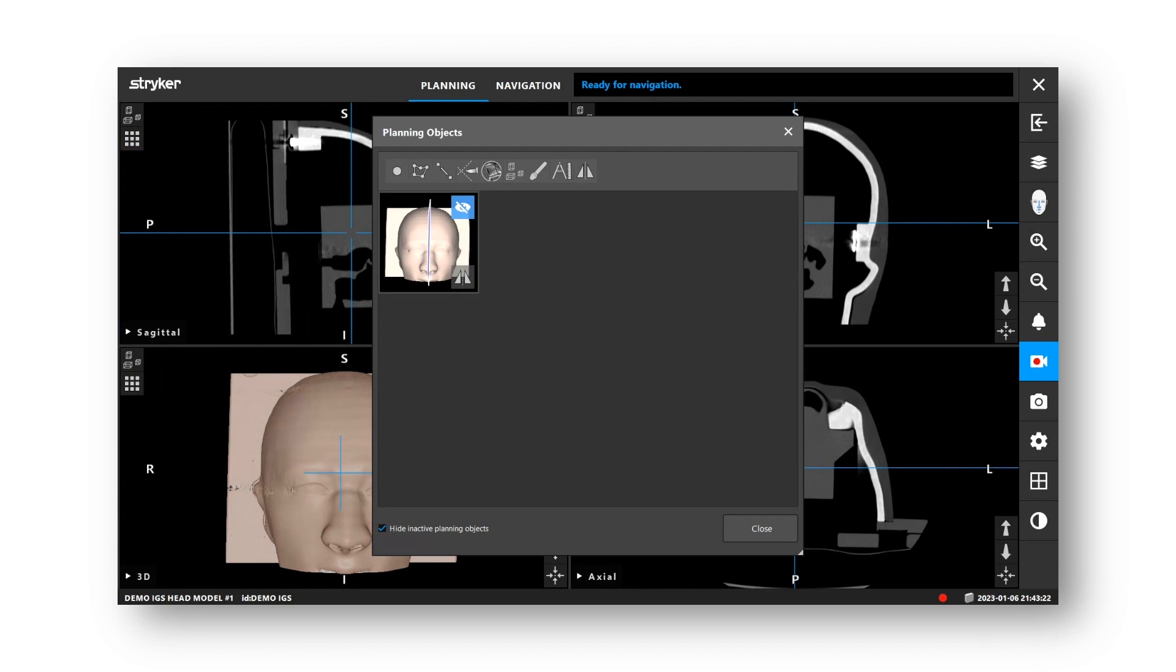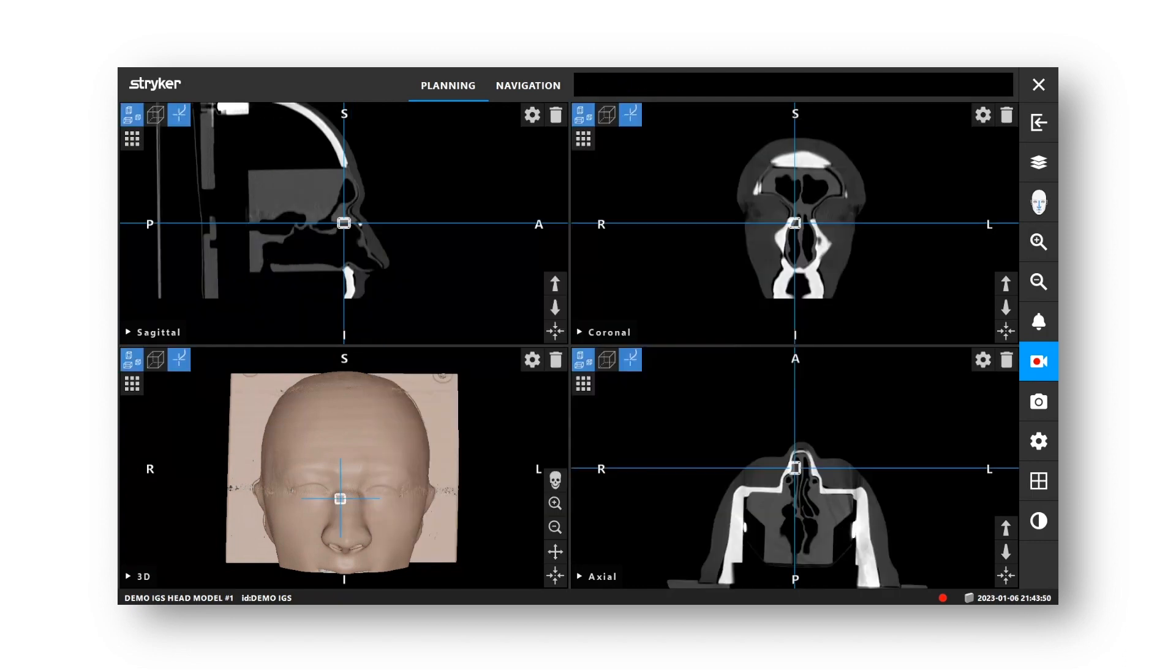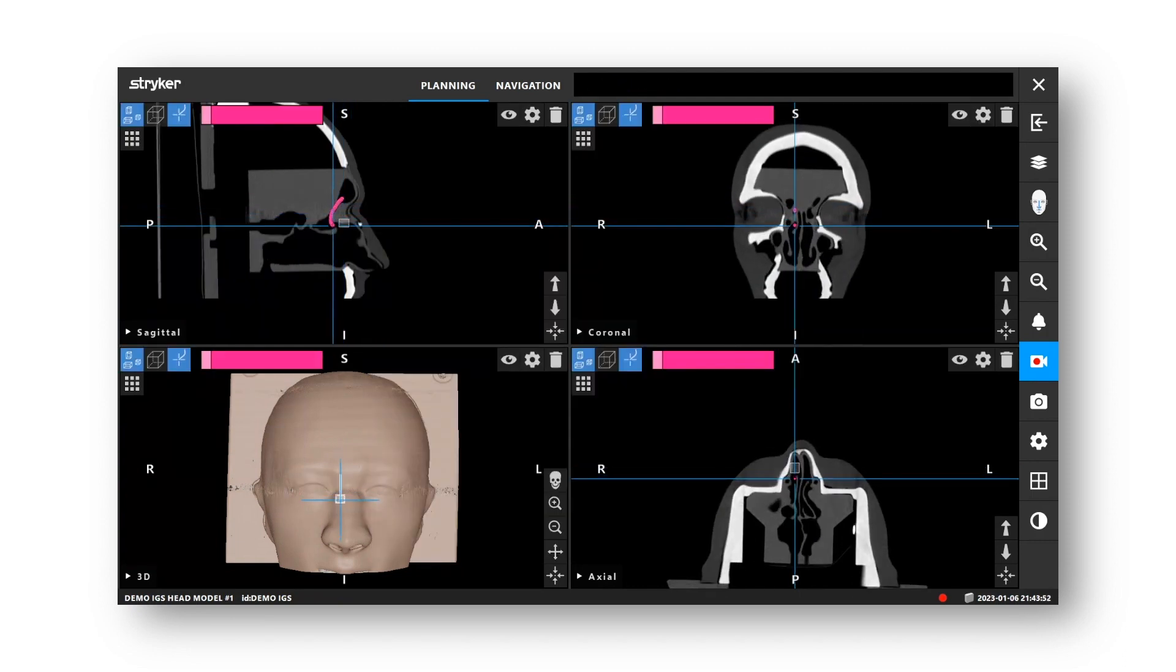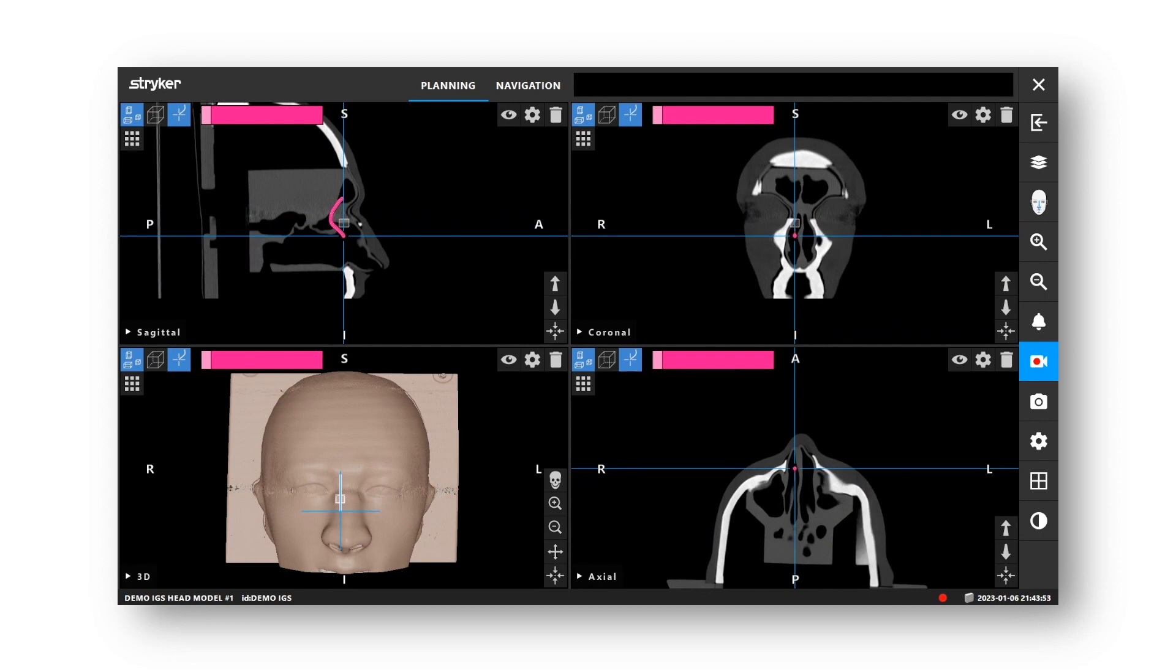Some of the available tools include planning points, which you can set up to be anti-targets or traditional targets; bone segmentation, which allows you to mark parts of a patient's bone or soft tissue structure in a different color; and the building blocks mode, which allows you to map out the patient's frontal sinus anatomy with 3D boxes, as well as identify and highlight the frontal sinus drainage pathway using three-dimensional tubes.